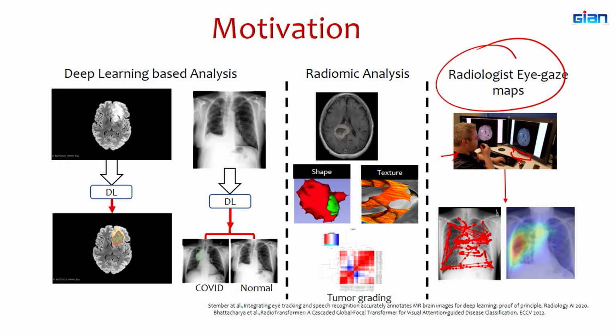Okay. So this eye tracker, what it does is, when the radiologist looks at a screen, they will be focusing on certain regions of the screen, right? So the pupil will be focused on, let's say we are looking at this image. When I look at this image, I might first look at, let's say, the top left corner, and then I might say, okay, what's going on here, then I might come here, oh, okay, it's very interesting here, then I might zoom into that region, right? So similar to what you see on your phone. A lot of times, let's say there's an interesting picture that you have taken, and while you have taken the picture, you see, oh, there's someone photobombing my picture.